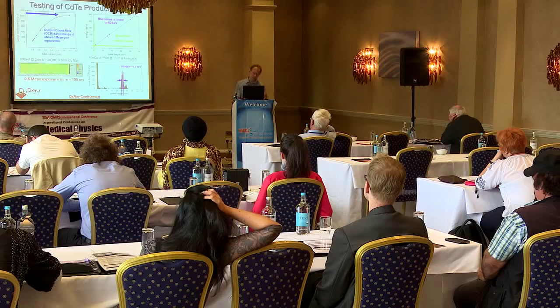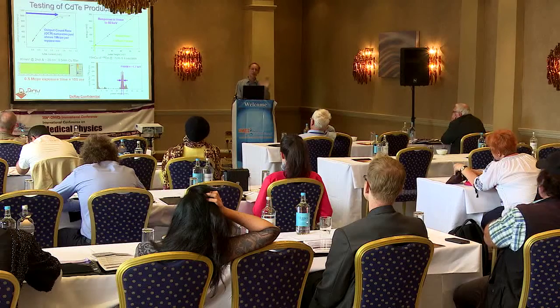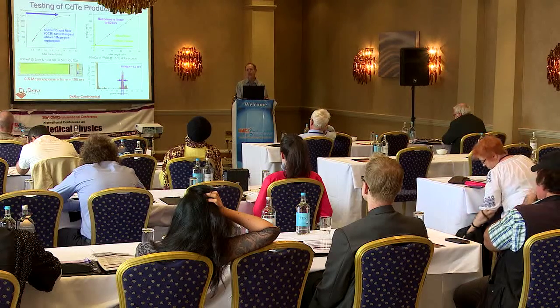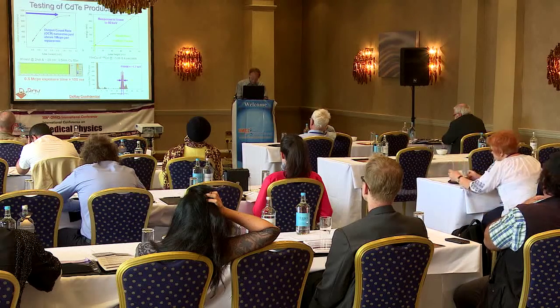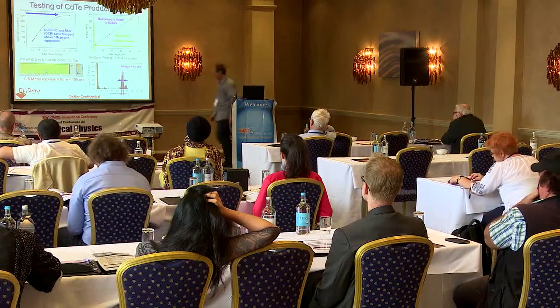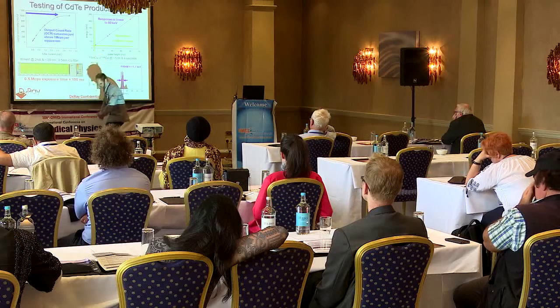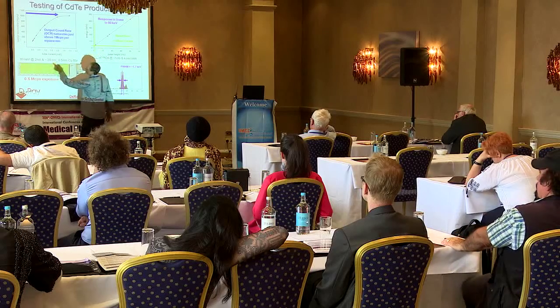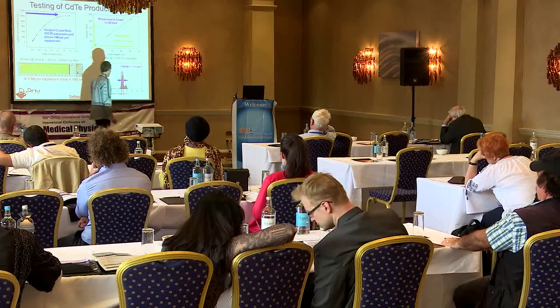So in this system, we have an output count rate up to 1 million counts per square millimeter, which is sufficient for the tube currents used in this application, and a linear energy response up to 80 keV, which also fits with the dynamic range for that application. Here you can see a flood, and again, in the long line, which we make so that we can scan the long bones of the patient in one direction, we use smaller pixels in between the crystals that we place so that the pixel pitch is preserved.